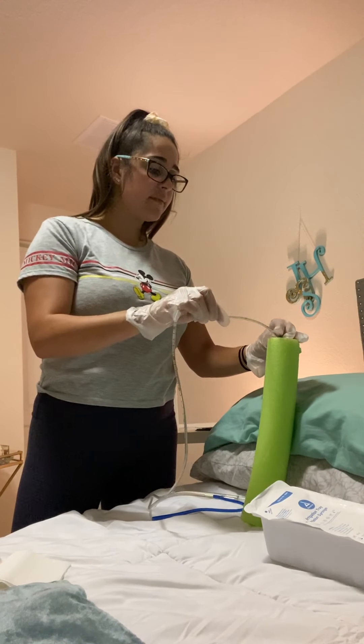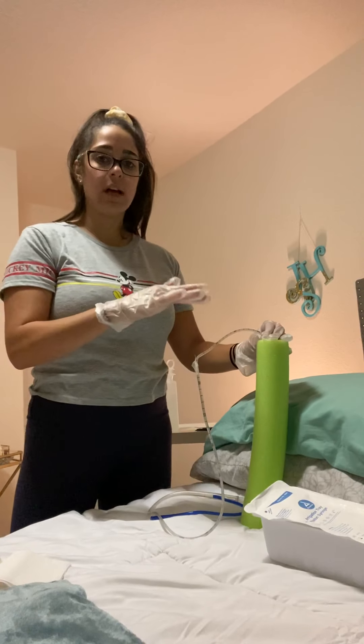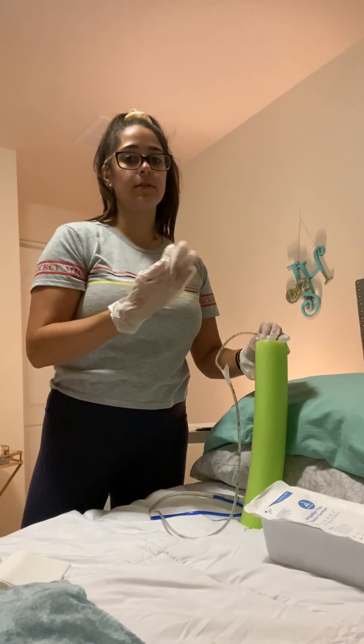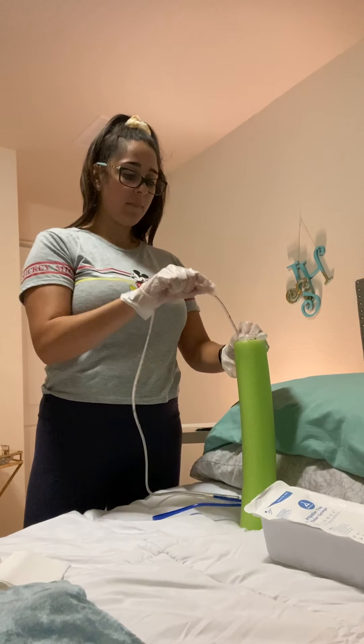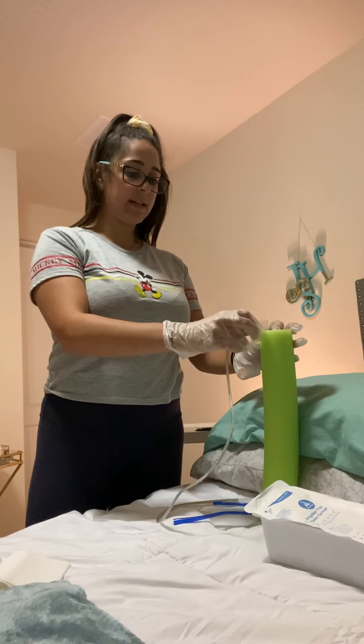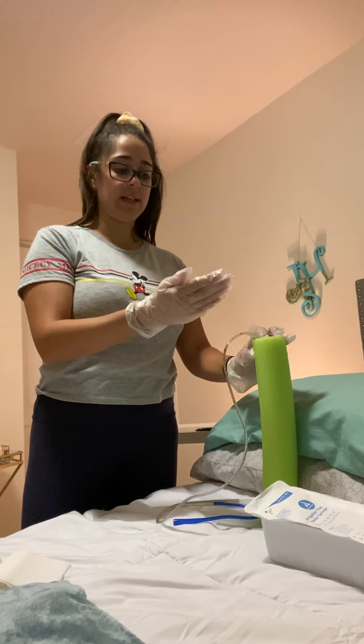When I get to 25 centimeters I'm going to stop, which will be around the esophagus, and listen for air. If there's air I know it's in the trachea; if not, I'm going to continue to my marker. Once I get to the marker, I'm going to get a pen light and a tongue blade and check to make sure the placement is correct.